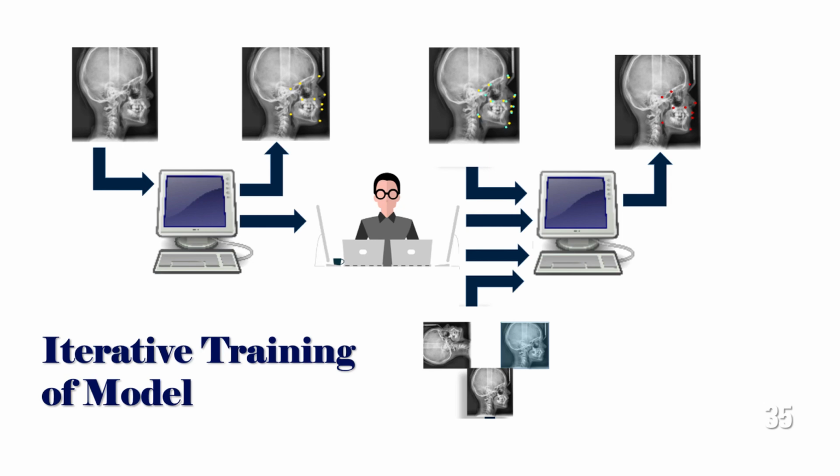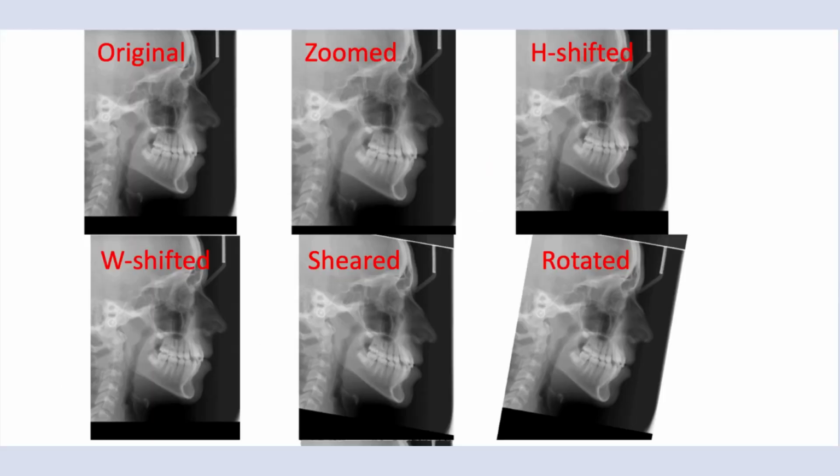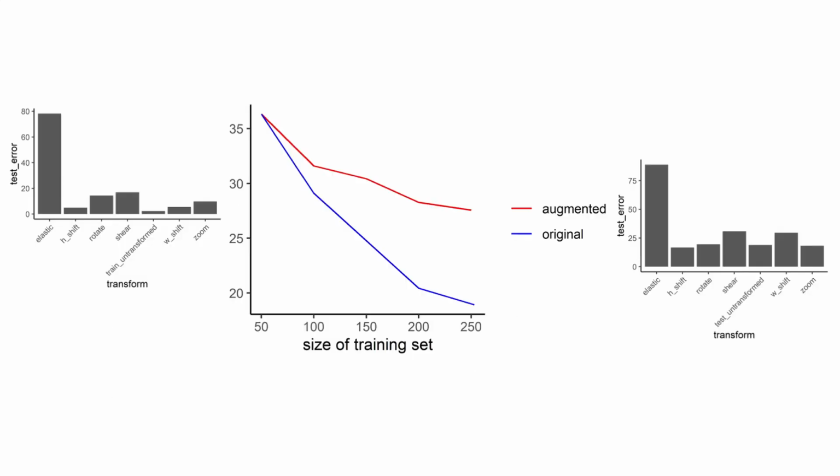However, a second source of training data was also used. As employed by Dr. Upadia's previous study, data augmentation was also used to artificially increase the training set size. So human annotated images were further augmented through techniques that included random rotation, flipping, random translation in any direction, changing the brightness, and gamma correction. This error-specific multiple augmentation technique made the model very robust because the model is receiving significantly more varied training data while requiring minimal effort on the part of the human experts.